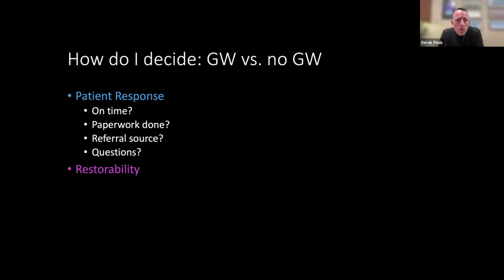And so in a lot of those cases, I go, you know what? I'm going to do a traditional root canal. I may not have time to run the GentleWave, and that just is what it is. Versus the other patient that's 15 minutes early, has all their paperwork done, and is in your chair at the top of the hour, and you've got a whole hour to do whatever you need to do. And I think a lot of us in here can do a root canal in about an hour. And I think the GentleWave doesn't add any time. In fact, on the cases I'm going to show, I put the times on how long it took me, and my times are from rubber dam on to rubber dam off.